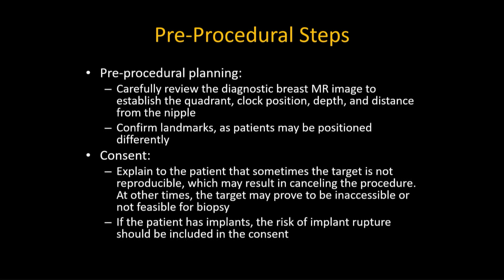So I always tell my residents and fellows that the pre-procedural steps are as important, if not more important, than the procedure itself. Pre-procedural planning for any breast biopsy is important, but I feel that it is particularly important for breast MRI. And therefore, it's important to carefully review your diagnostic breast MRI image.